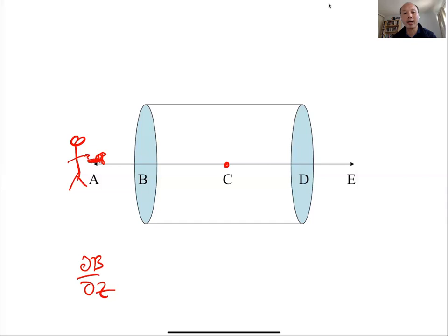So what I want you to think about is if, for example, you are so unlucky as to have a wrench pulled out of your hands into the magnet, where is it going to go next? Is it going to go to B, C, D, or E? Okay, and then what happens after it goes there? So there's going to be two destinations for the wrench. So when you come back from the breakout room, we'll have a poll. And so the question will be, what's the first destination? And then what's the second destination? Okay, there's two major destinations for this wrench.